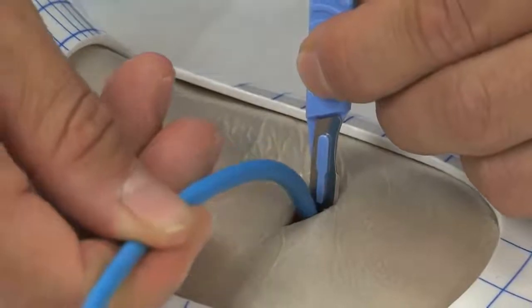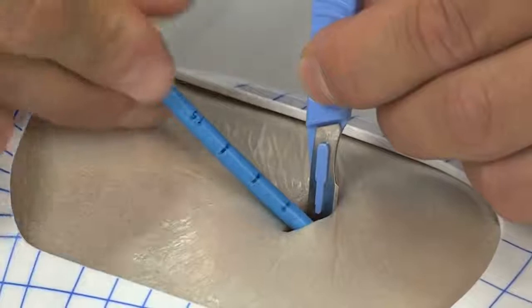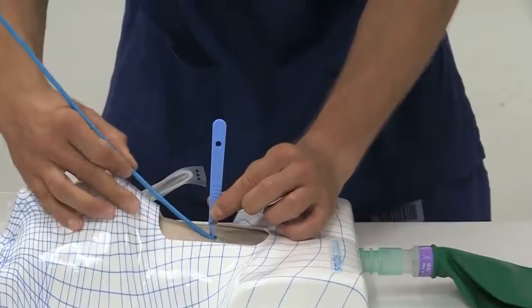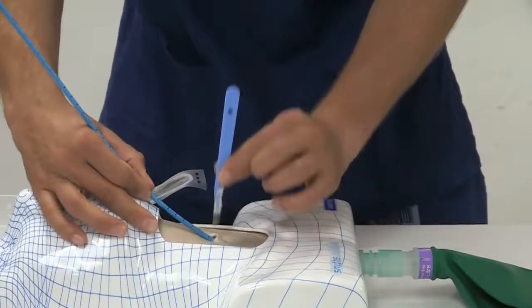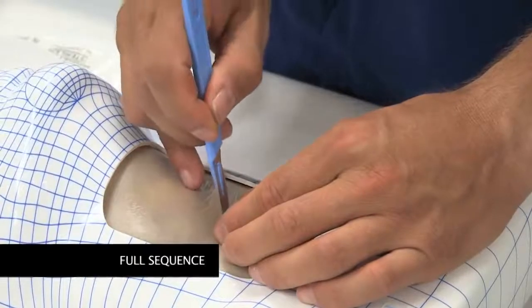It is usual to feel a pop as the bougie enters the airway. The bougie then needs to be rotated and aligned with the airway before it is advanced into the trachea. Advancing the bougie into the airway should be a smooth procedure requiring not more than two fingers and gentle pressure.